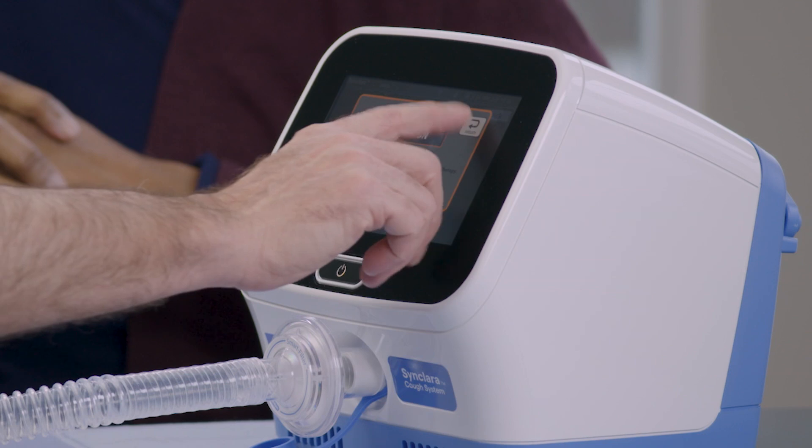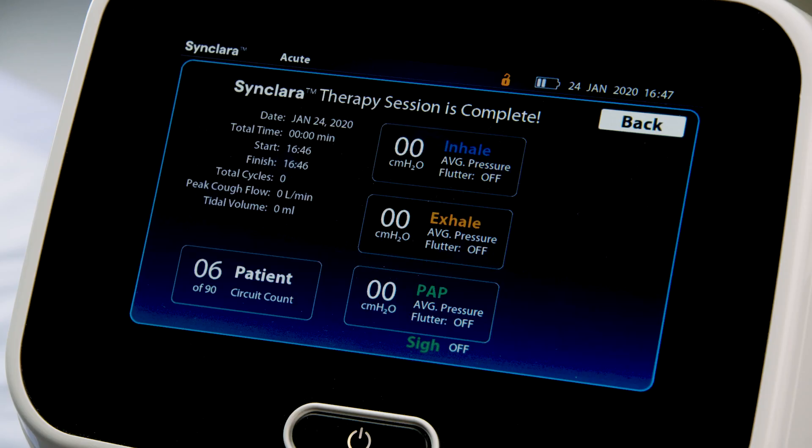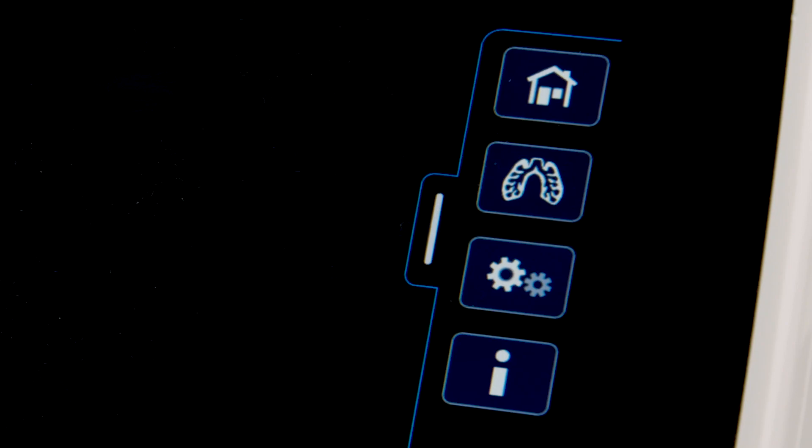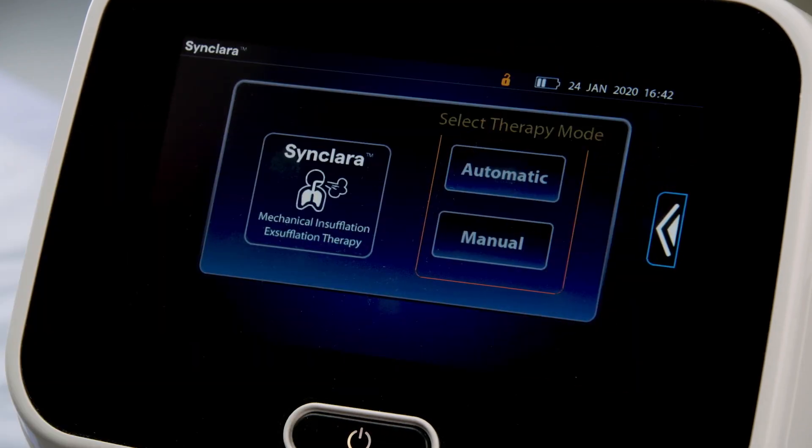When the therapy is complete, press Stop. The therapy summary is displayed. Press Back to go to the initial therapy screen. Swipe the Options tab left and press the Home menu control.